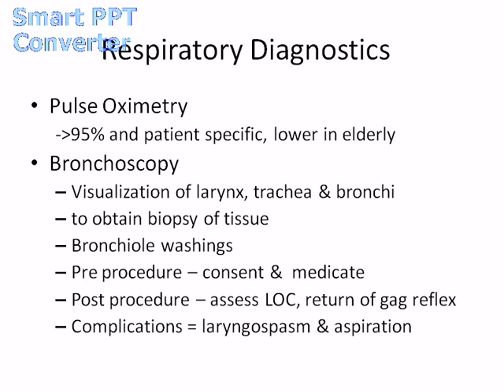So what we do as nurses, we want to make sure our patient doesn't have any allergies, as we always do, and get a consent. It needs to have a consent. Take their dentures out. If they have dentures, get those dentures out. Patient should be NPO 8 to 12 hours prior to the procedure, and we're going to pre-medicate them, typically using viscous lidocaine to numb the throat, or a spray back there, and then typically conscious sedation.